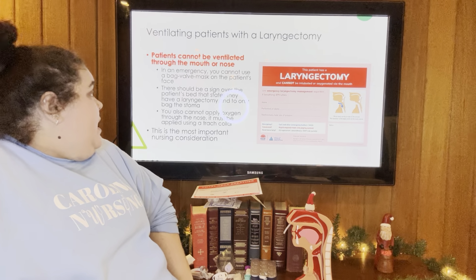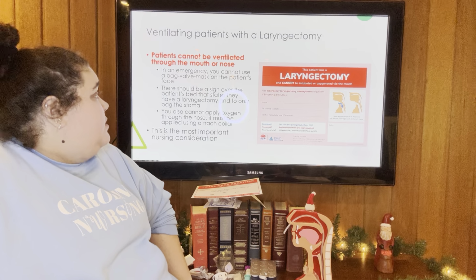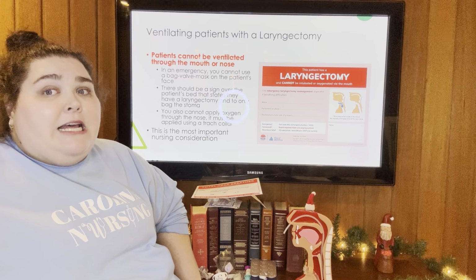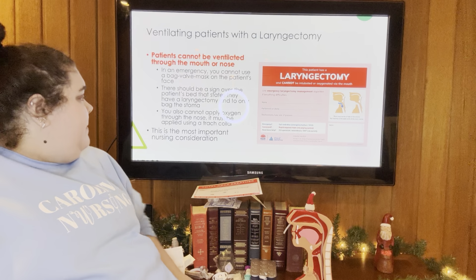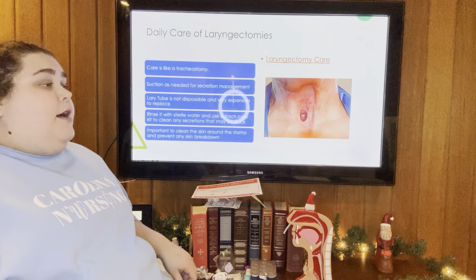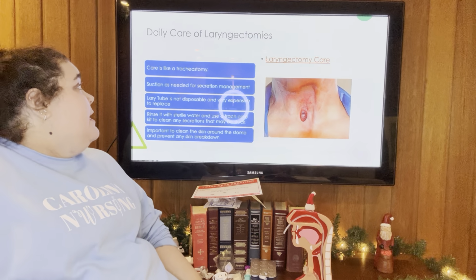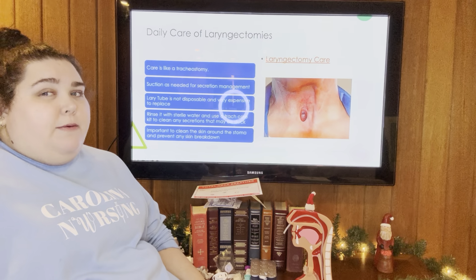So we talked about in an emergency, you need to use the ambu bag on the stoma. Usually we prefer that you use an ambu bag with a pediatric mouthpiece or an infant mouthpiece. That way it just fits over the stoma a little bit better. And so it's the most important nursing consideration about laryngectomies, and the most important difference to note between laryngectomies and tracheostomies. So daily care of your laryngectomies, it's very similar to a tracheostomy, but you don't necessarily care for the tube in the same way.